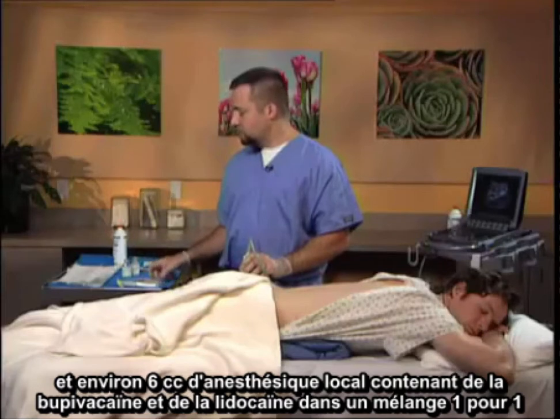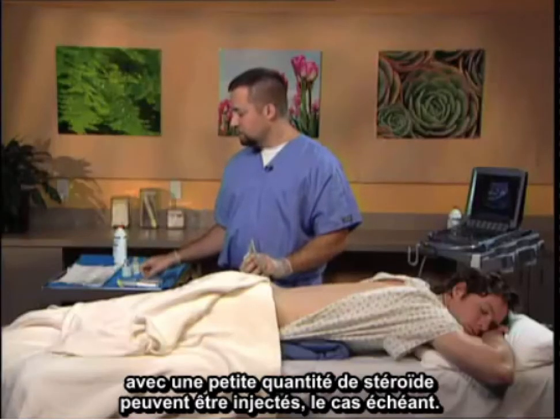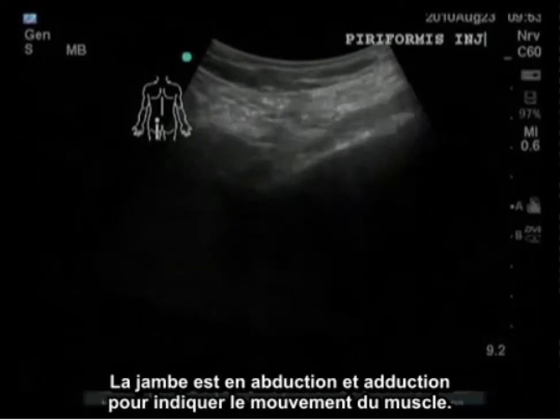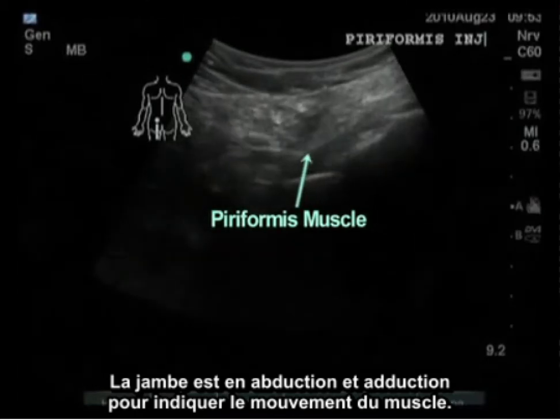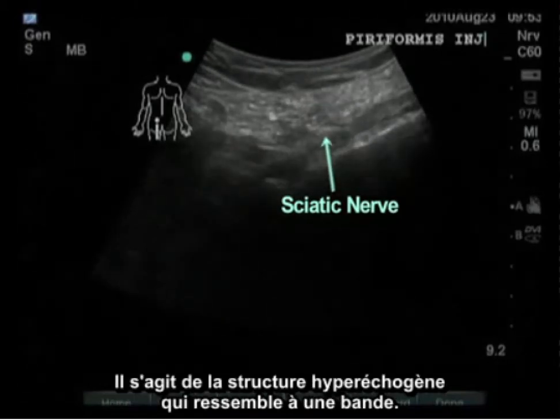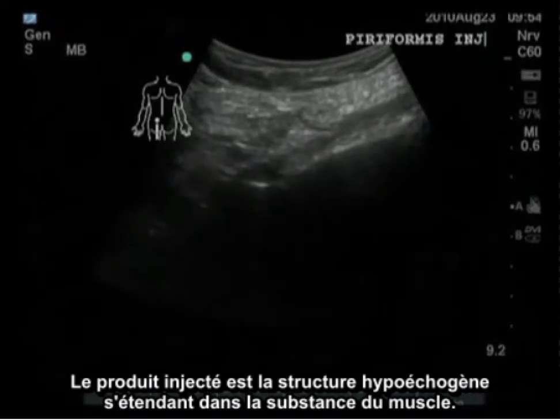The skin is marked and then 1% local anesthetic is injected directly in short axis view. Approximately 6 cc's of local anesthetic containing bupivacaine and lidocaine in a one-to-one mixture with a small amount of steroid if desired can be injected. This is the short axis view and the curvilinear probe is applied in the transverse orientation. The leg is being adducted and abducted to show the muscle moving. The sciatic nerve is clearly visible in the substance of the muscle — it is the band-like hyperechoic structure. The injectate is the hypoechoic structure that grows within the substance of the muscle.